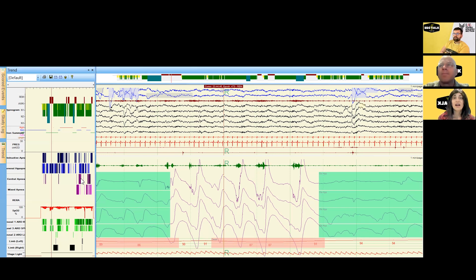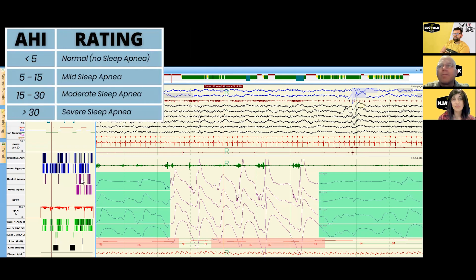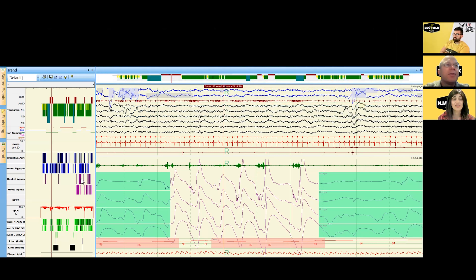For adults, we use a cutoff of 5 events per hour plus clinical symptoms to constitute a diagnosis of obstructive sleep apnea, or an AHI of 15 per hour regardless of whether symptoms are present. You'll often see designations of mild, moderate, and severe: mild is 5 to 15, moderate is 15 to 30, and severe is 30 and above. This is a severe case.